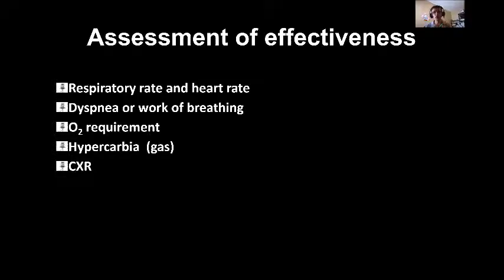Of course, to give higher level CPAP, you should have a machine that's able to do that, and you have to have good monitoring. So you do an X-ray. What is the best use of the X-ray? It shows the degree of inflation. So you look at how your diaphragm is, flat, and how many ribs.